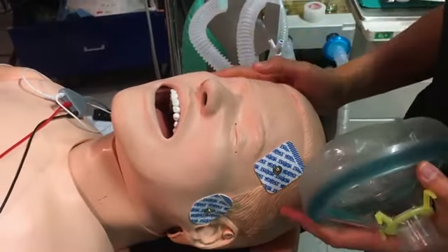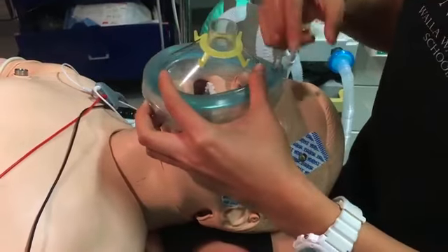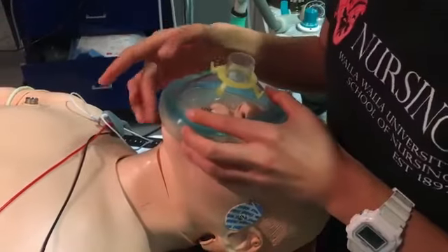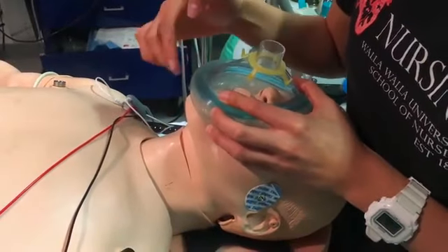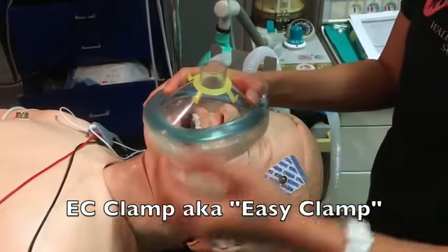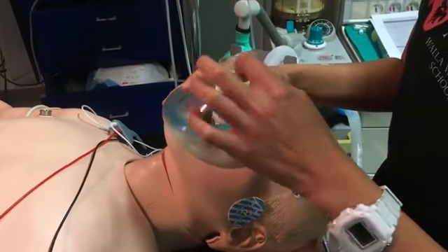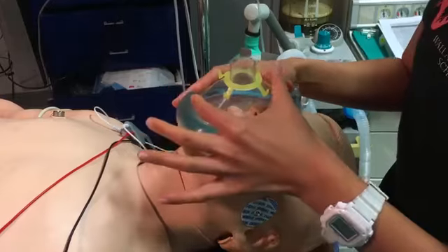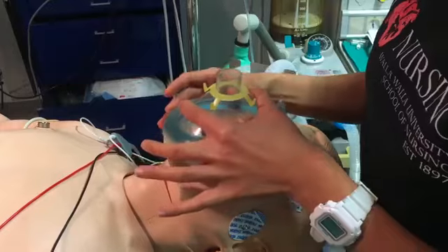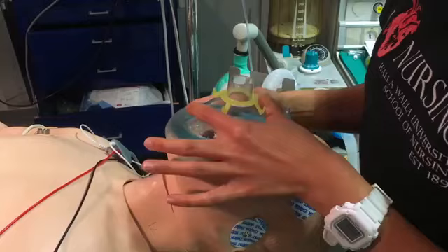When masking a patient, you want to make sure you place the face mask appropriately. The top part should be aligned with the pupils. The sides should be by the nasolabial folds, and the bottom part of the mask should be between the lower lip and the chin. So you use a technique called the EC clamp. Basically, you make a C. The C part is your thumb and your index finger, and the E part is the last 3 fingers. You want to put your thumb on the top part of the mask and your index finger on the bottom to do counter pressure to keep the mask on the patient's face.